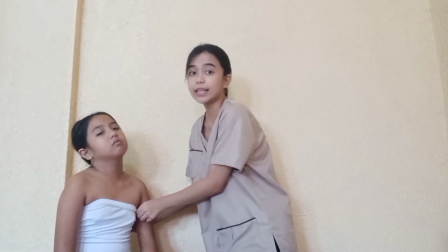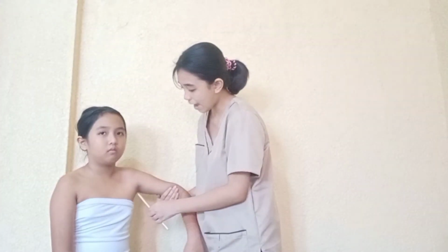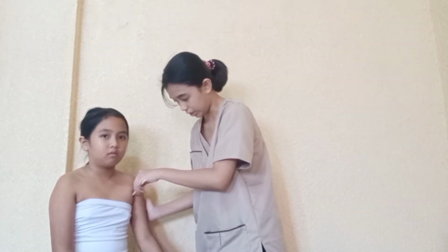So after that, I'm going to remove the probe from the recording unit of the electronic thermometer. Assuming that this is an electronic thermometer for the axilla, I'm going to place a disposable probe cover on by sliding it on and snapping it securely. Next, I'm going to place the end of the probe in the center of the axilla and have the patient bring the arm down and close to the body.